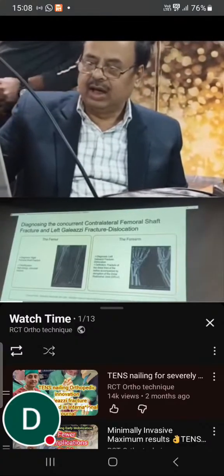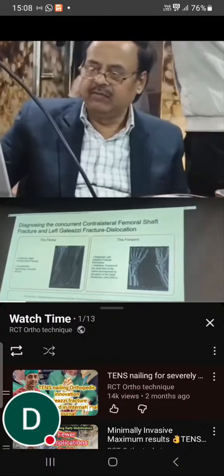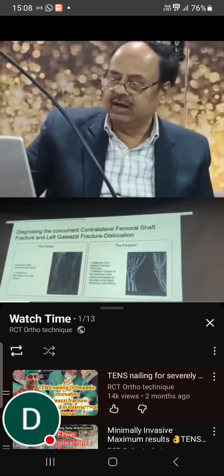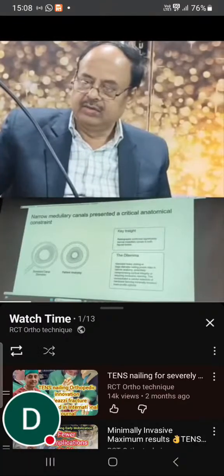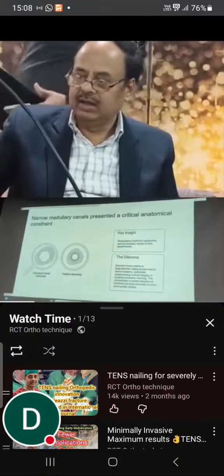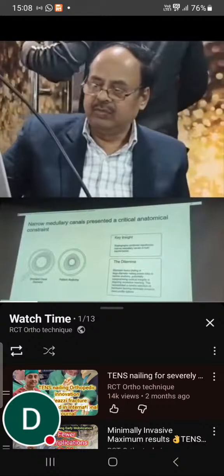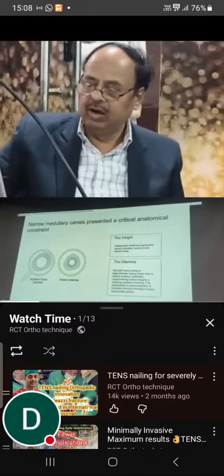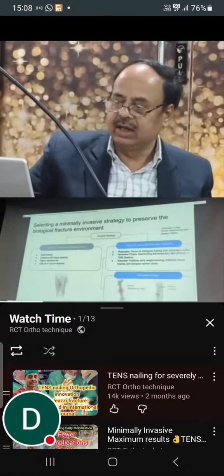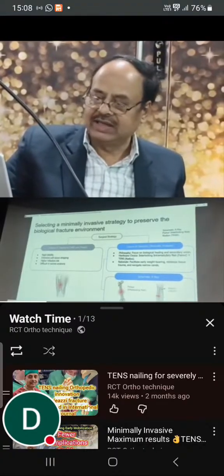And this is the X-ray of the femur, the shaft femur, a mid-third fracture of a 17-year-old gentleman, and the forearm Galeazzi fracture, a severely displaced fracture. The inner canal was narrow, so the nailing was difficult. The standard treatment is nailing, and the ideal treatment for this Galeazzi fracture is plating. But I opted for nailing, although it was difficult nailing in both fractures.